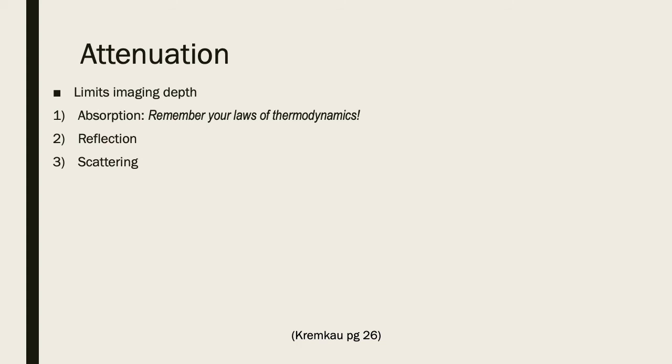As these particles are vibrating, the energy is being transferred from mechanical to thermal. The next way that sound can be attenuated is by reflection, and then by scattering of sound as it encounters different tissues. We'll talk a little bit more about that later on in the lecture.